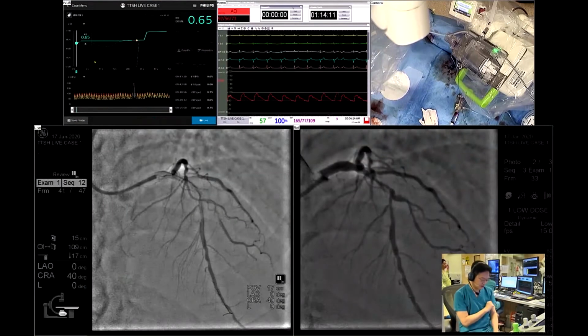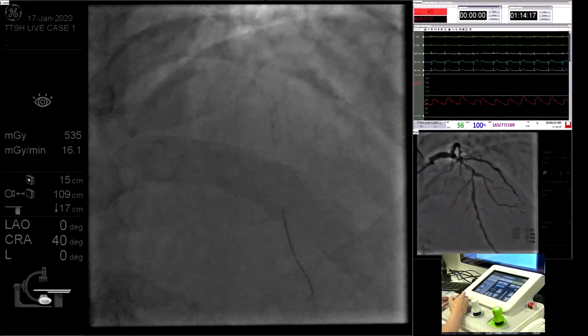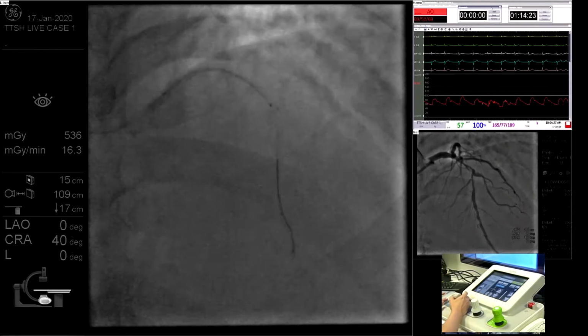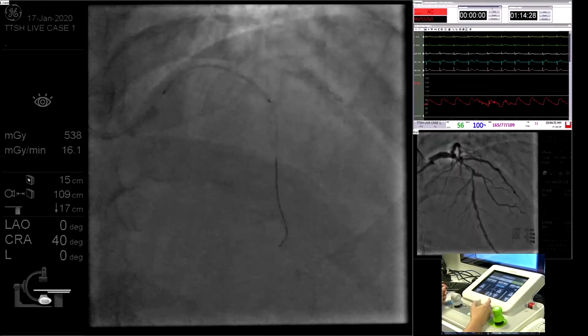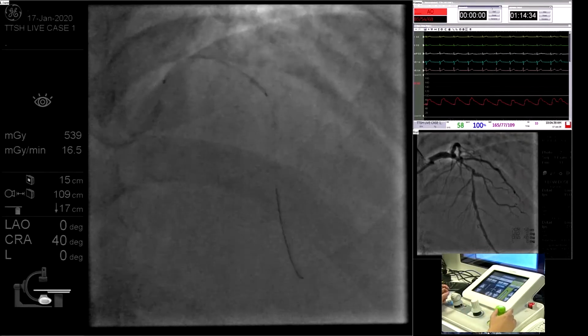Okay, so Chiang, I'm going to go back, and Deborah already put the stent near the guide for me. So I'm going to go back and try and get this stent down. Let's see how this behaves. Ooh, the guide came out. So I want a bit more wire. Okay, and I need a bit more guide support.